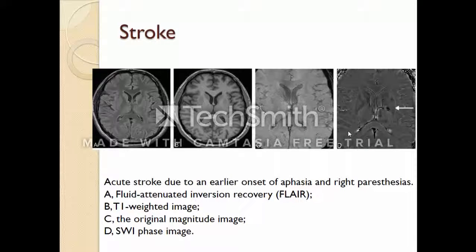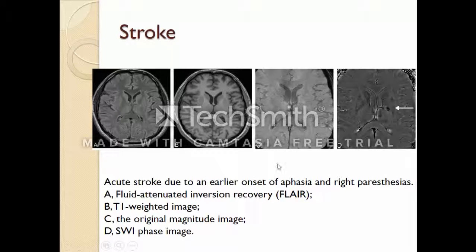Our next photograph series is about stroke. Here you can see an acute stroke case due to an early onset of aphasia and right paresthesias. As you can see, there is no abnormality in picture A or picture B. Picture C also seems quite normal, but when we look at the susceptibility weighted image we can see this little lesion indicated by the white arrow.